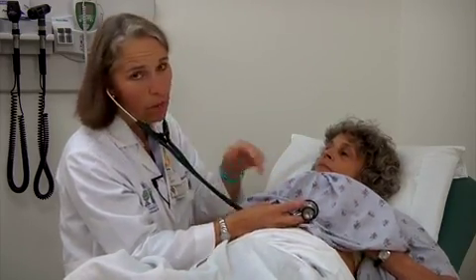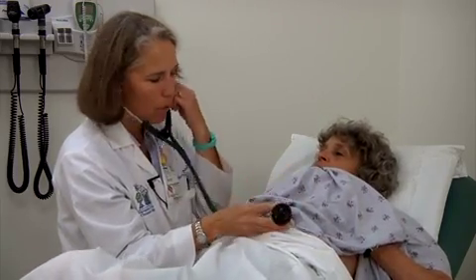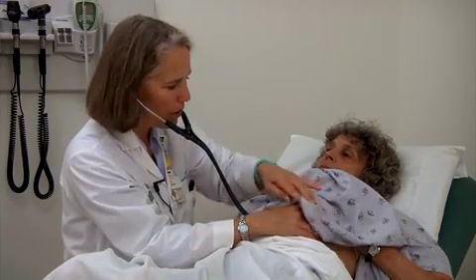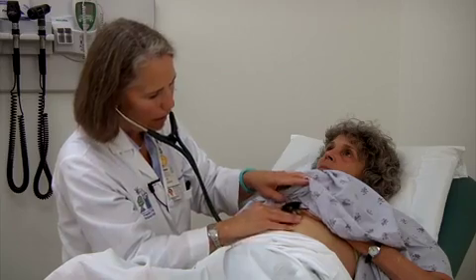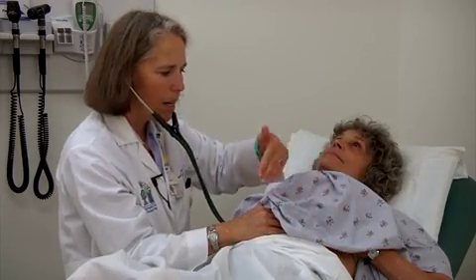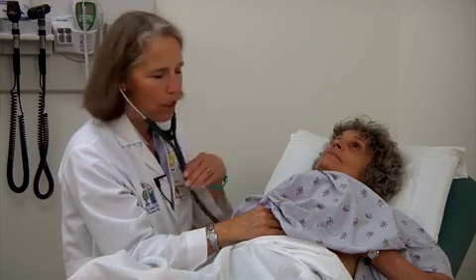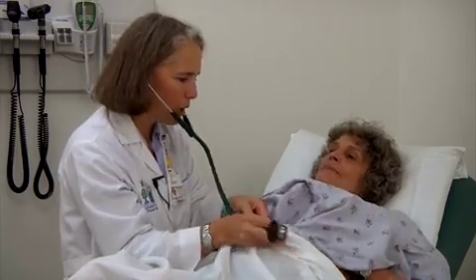While she's still helping me, I could at this point modify my exam and listen with the bell. Because the mitral area is still exposed, I can listen for those low-pitched sounds. I can listen at the tricuspid area for the low-pitched sounds. In the man, I did the four areas sequentially, but because she's helping me, we can just modify our technique slightly. Thank you, and you can relax.